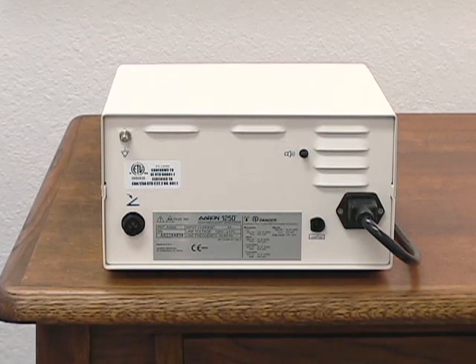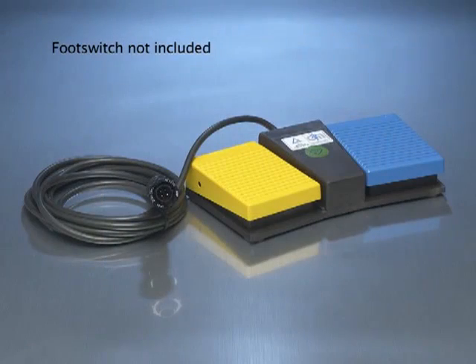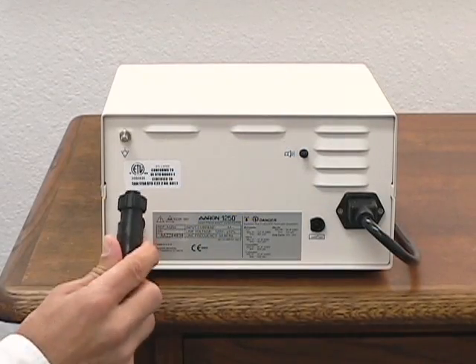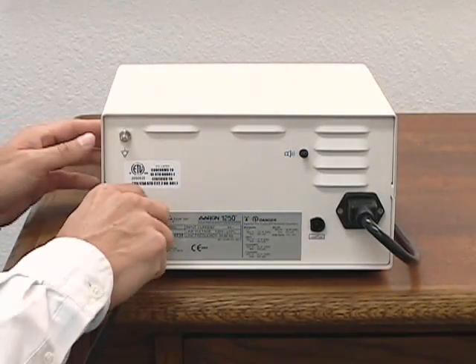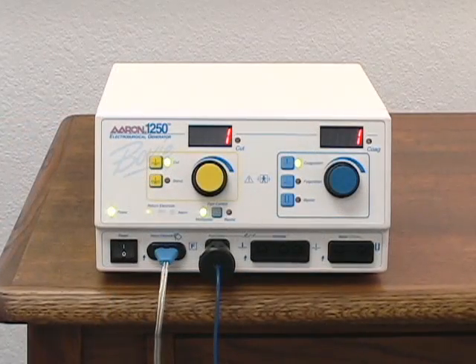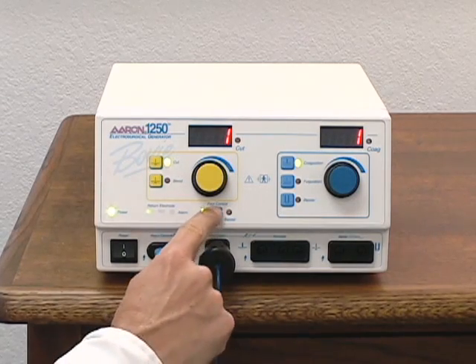Foot control accessories can only be activated via the optional foot switch. To attach the foot switch, plug the connector into the back of the unit. The same foot control is used to activate the monopolar and bipolar modes. To toggle between monopolar and bipolar foot control modes, use the foot control selector switch.